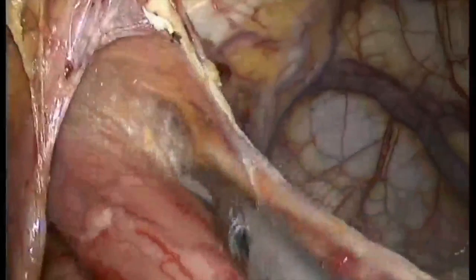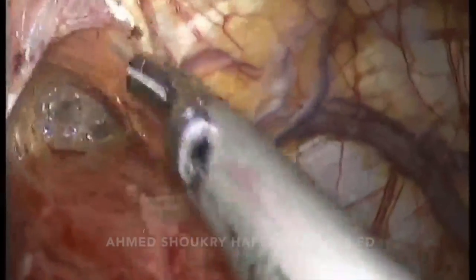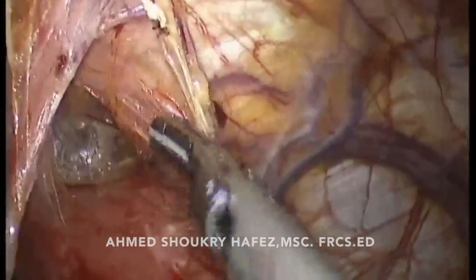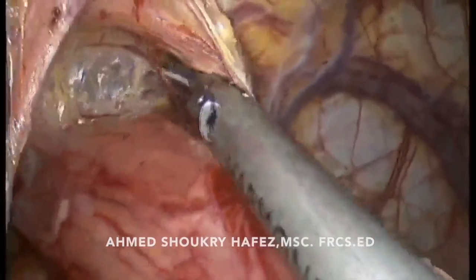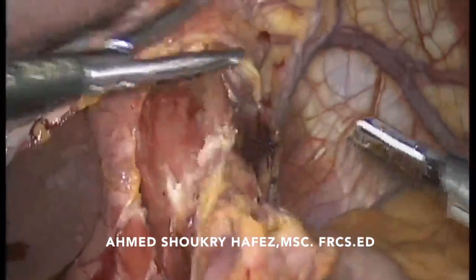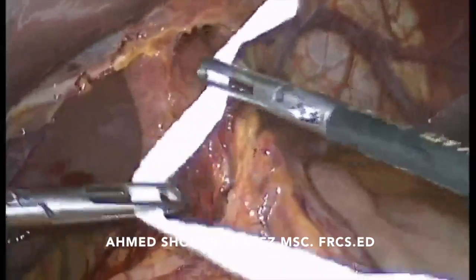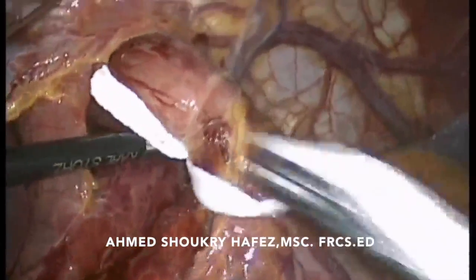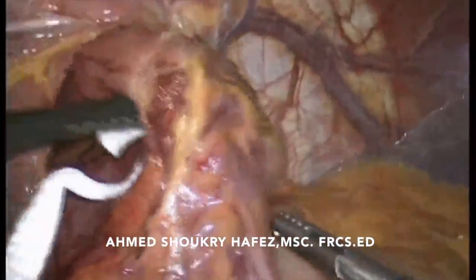In this part, you should be very careful as the anterior vagus lies right there. It is between the esophagus and the upper part of the left crus of the diaphragm. It is always hidden and always stuck to the upper part of the left crus. You must be very careful, as it is very easy to injure in this part. Now we can pass the tape and pull on the tape so as to continue our mediastinal esophageal dissection.